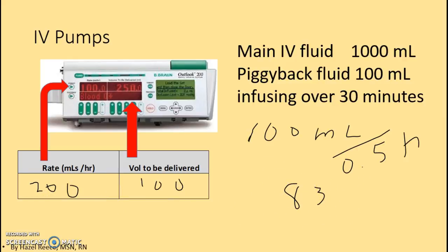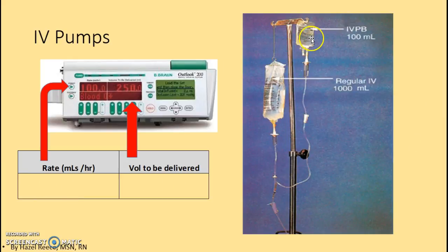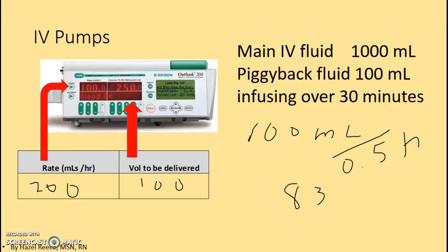Now, if you put it so that this bag is higher than this bag, then the medication's kind of going to be mixed in. In fact, this one might actually backflow into your smaller bag, and you really will have messed up your concentrations of medication in fluid, so that would not be a good situation.